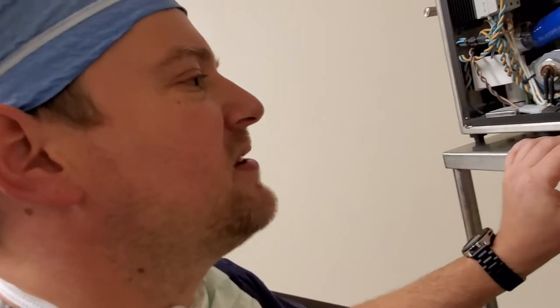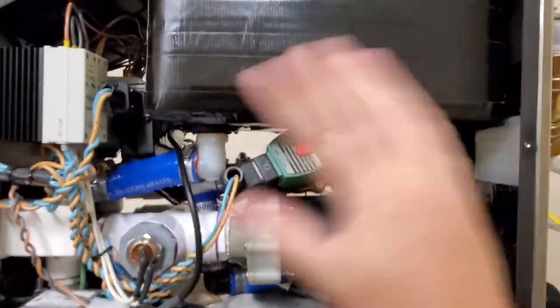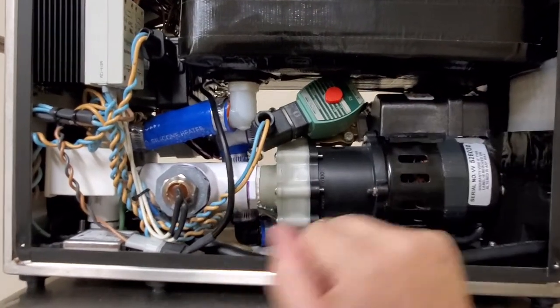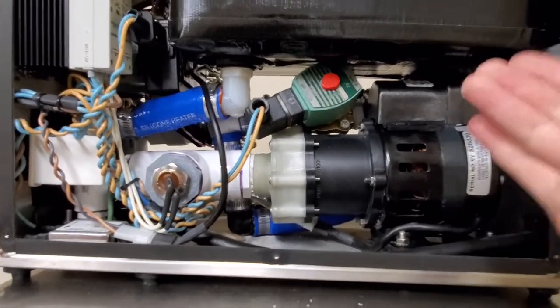So that's the question. If it's not very expensive, why do the PMs cost over $1,000 for this device? Something for you guys to think about. So when you open this guy up to do a PM, there's going to be dust absolutely everywhere. So you are going to clean it out. And I still probably have some dust inside it.